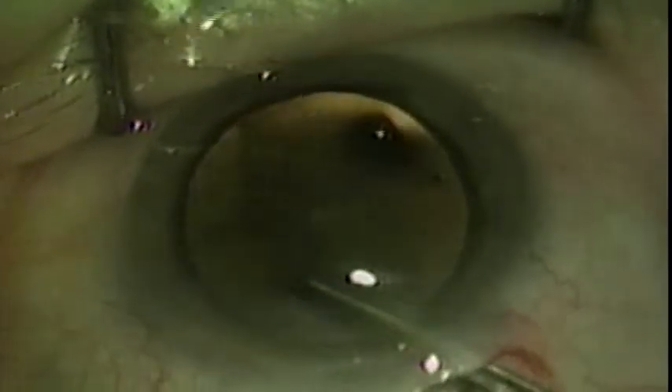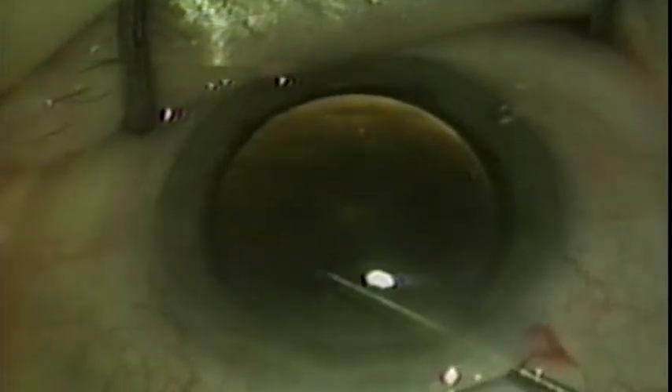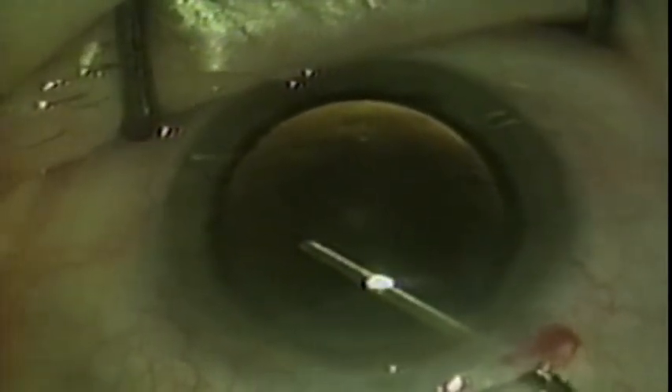At 12 o'clock, the tear is slightly directed from the outside in to encompass the original opening. Without releasing the forceps, the capsular flap can then be removed from the eye.